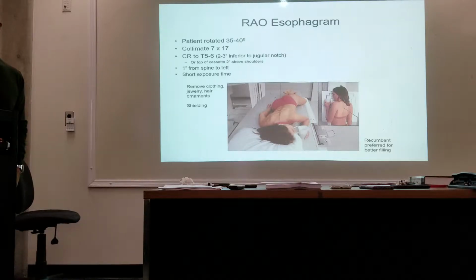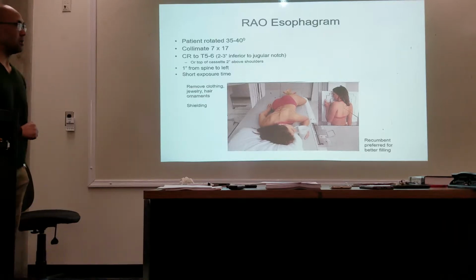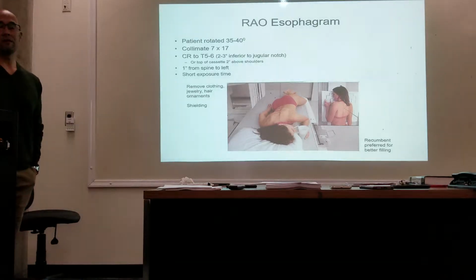Any questions? So drinking, they can drink, they're breathing. The thicker barium, they're going to have to hold their breath on the 3rd swallow. Okay? Any questions on RAO? All right.